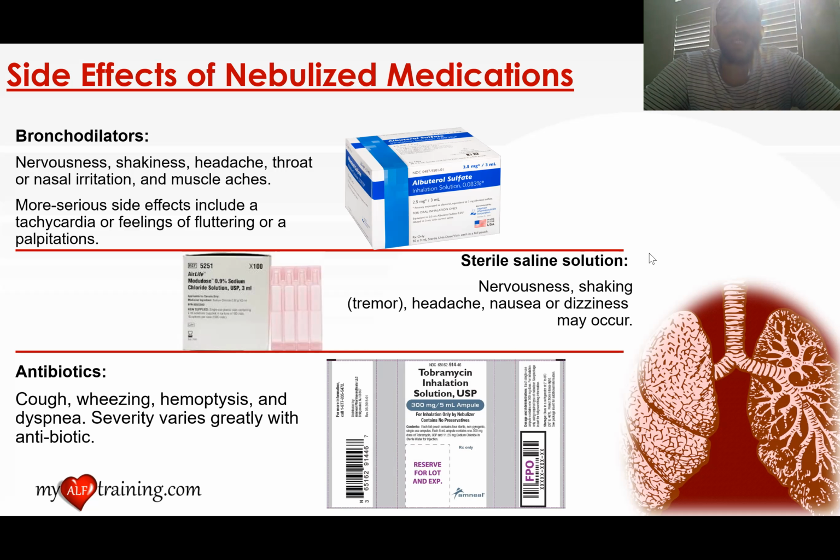I would say to take it before they've eaten if they are someone who usually has vomited before, or who complains of nausea.